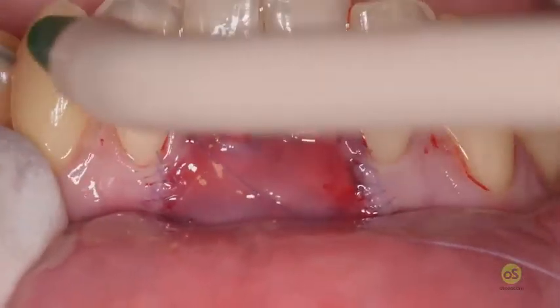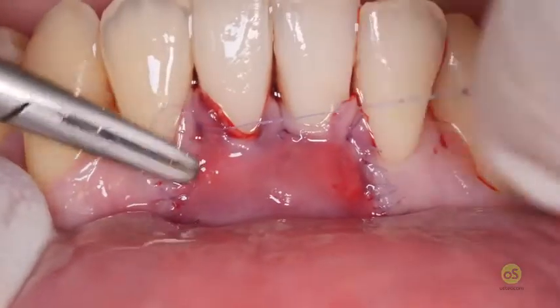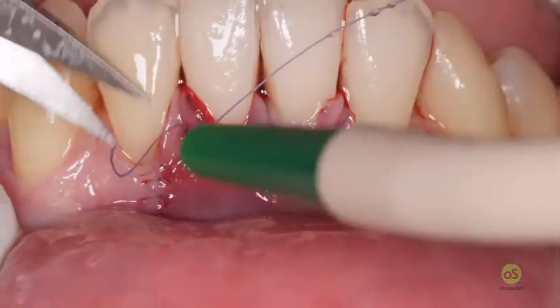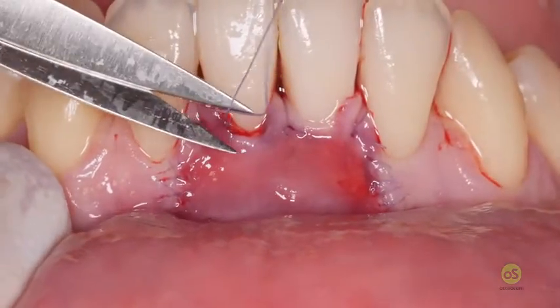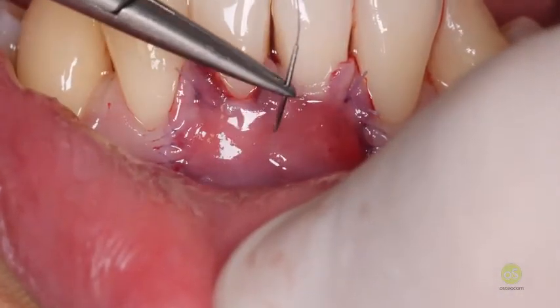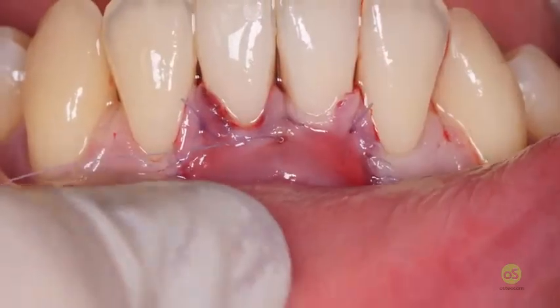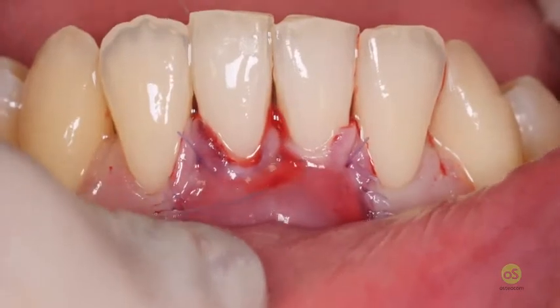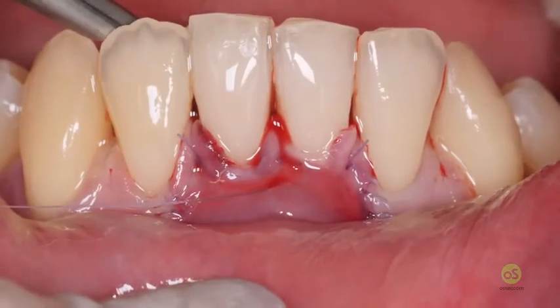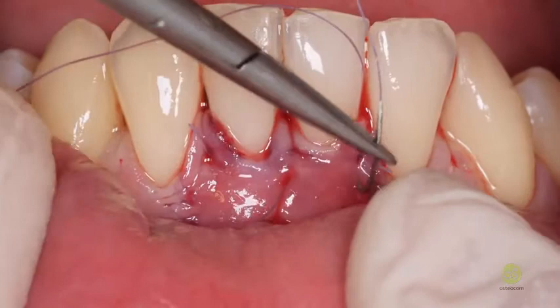Now the last one, which is the most important of all because it's the weakest point, the area of the interincisor papilla, should be always done again. So I will do it again, a bit more apical with respect to the previous one. Perforation, surgical, anatomical papilla. Take anchorage in one of the two papilla. It doesn't matter so much. We can use this time. A bit more apically than this.